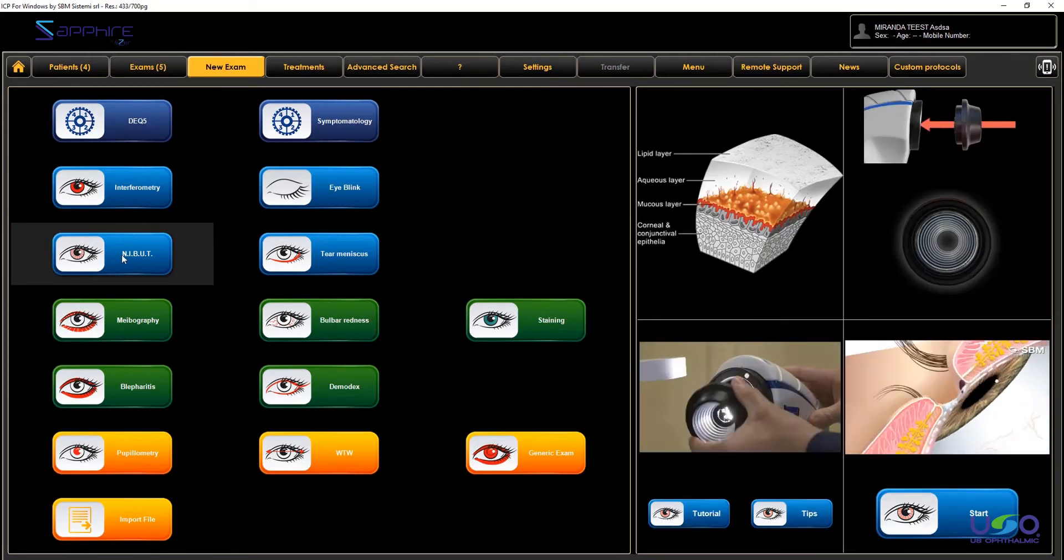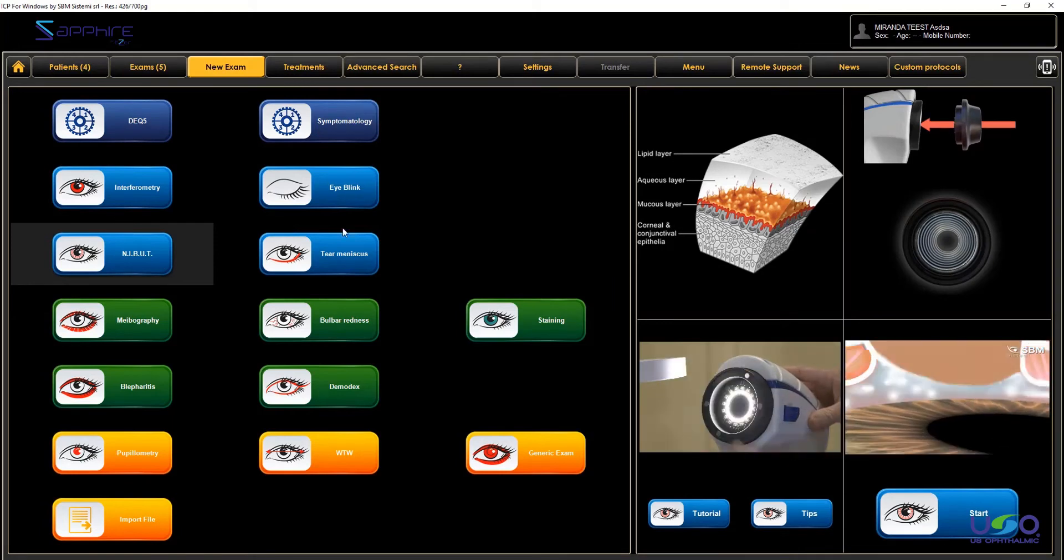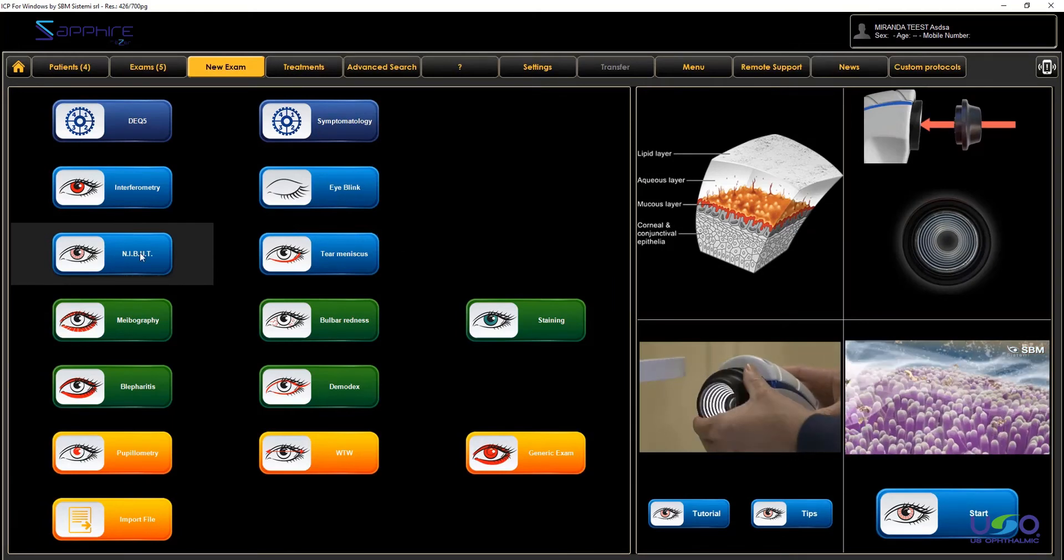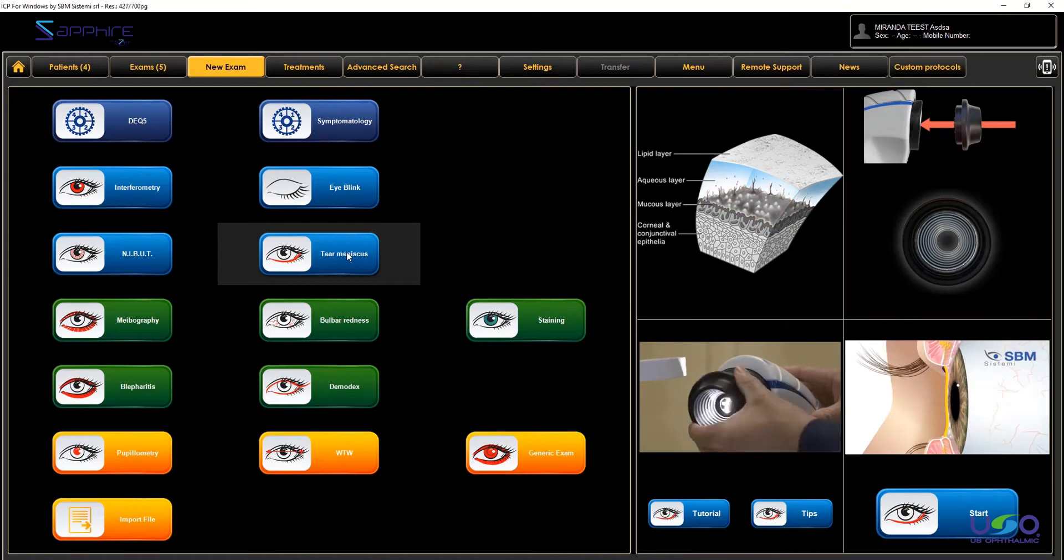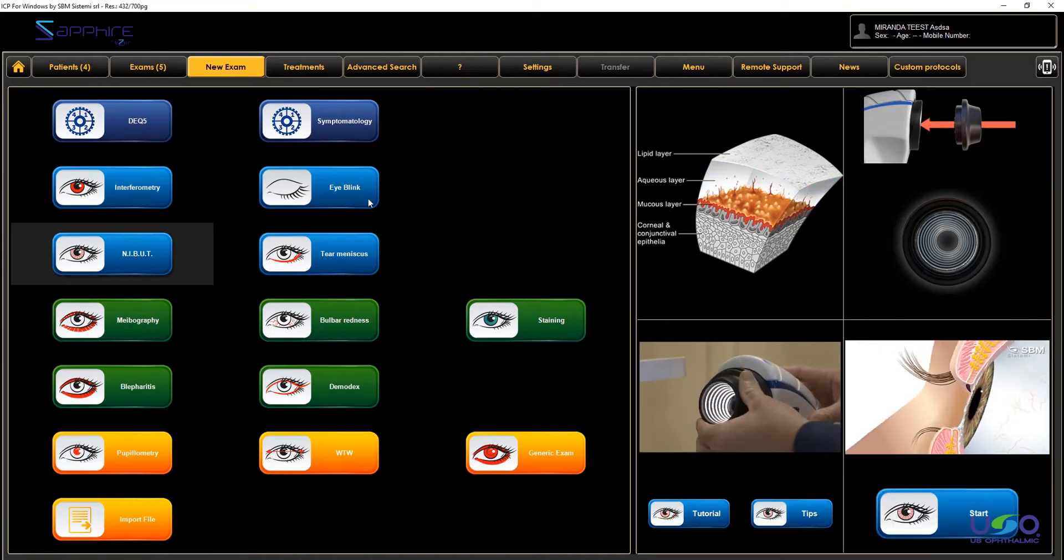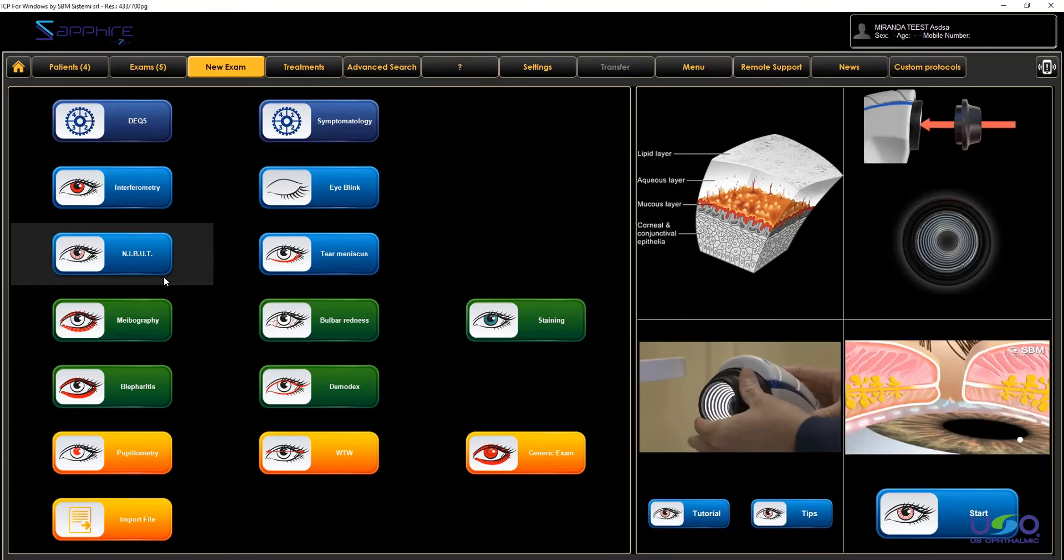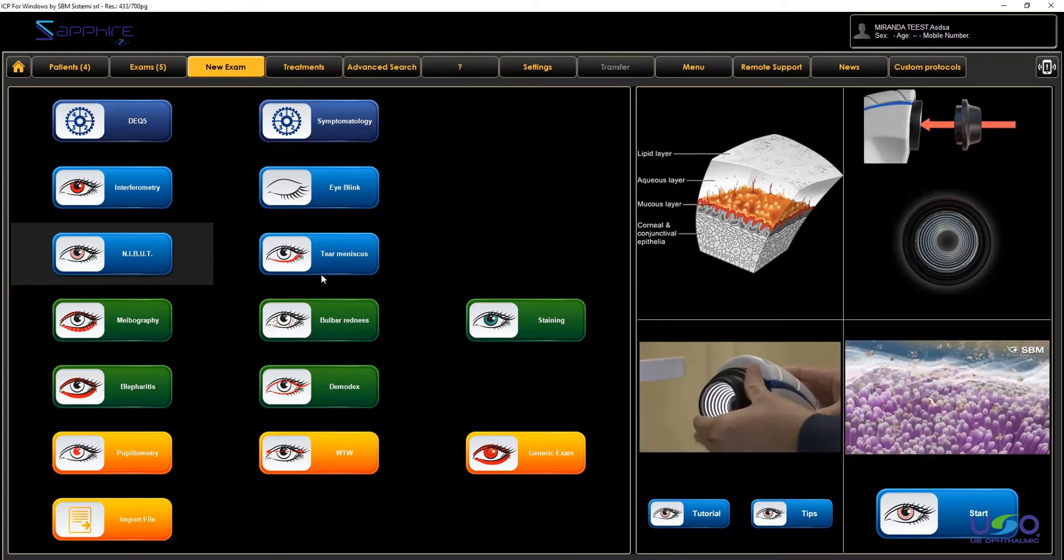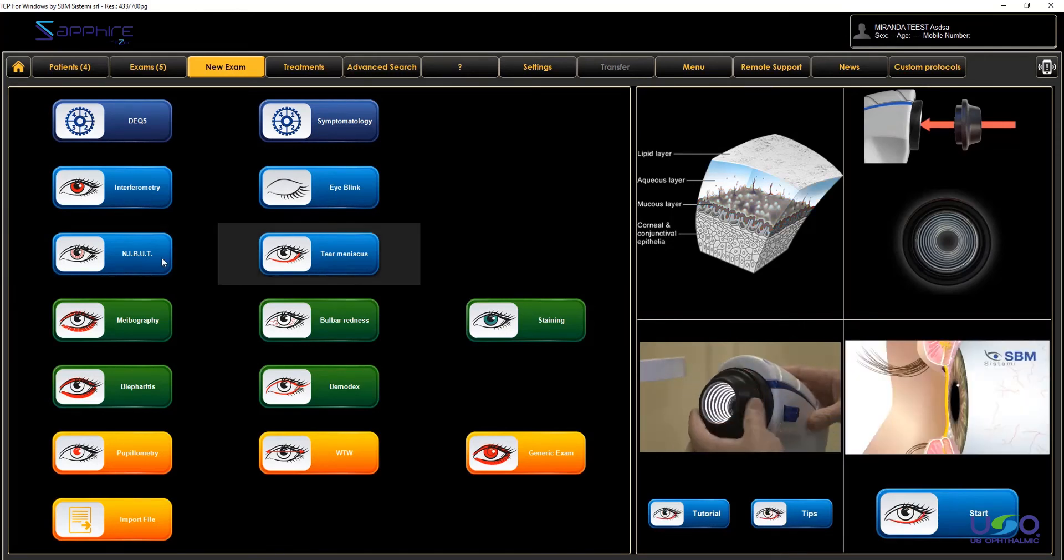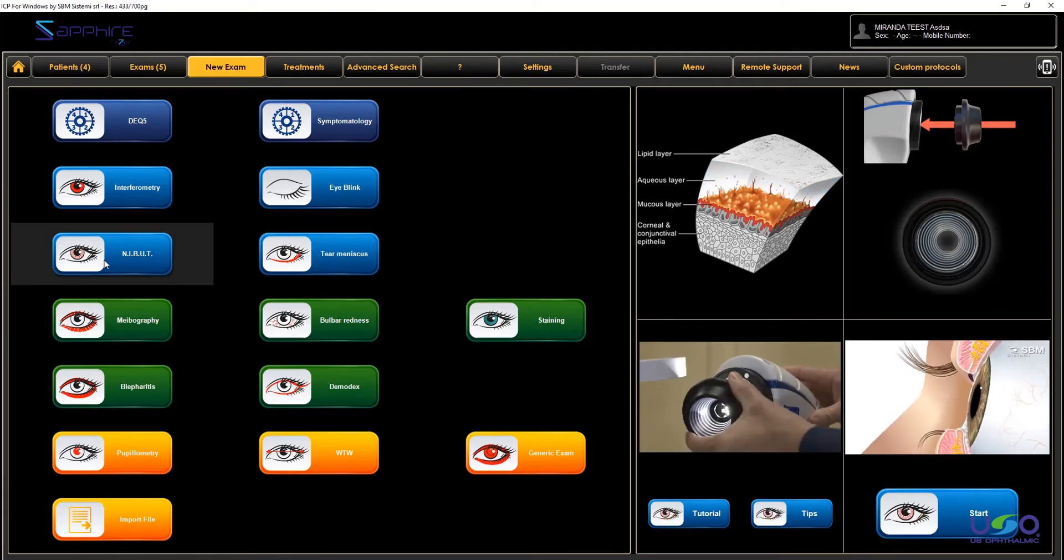Same thing as interferometry, you find another examination very close to the NIBUT examination, which is tear meniscus. It means that exactly for interferometry and I blink, with the NIBUT video, you can grab as well the tear meniscus evaluation. So in a single video, we take two different evaluations.